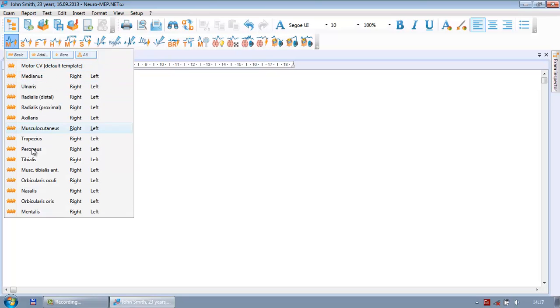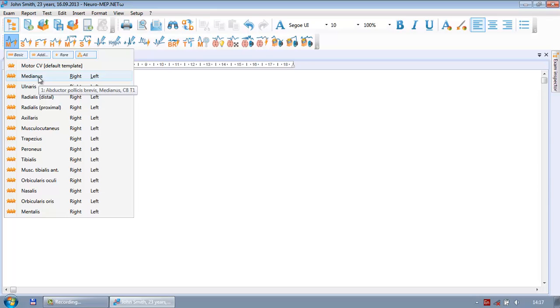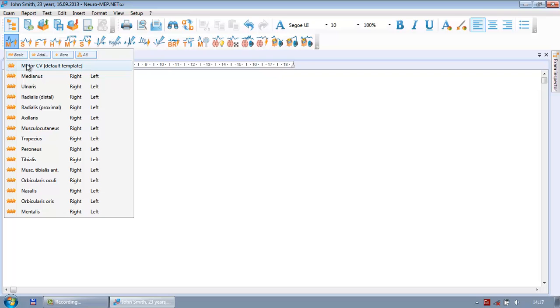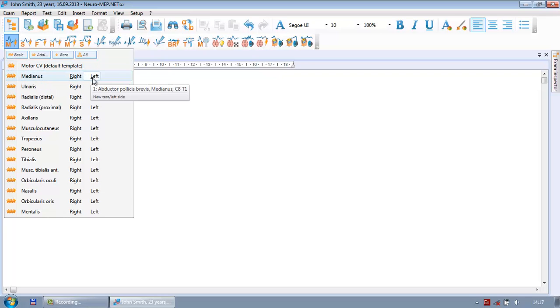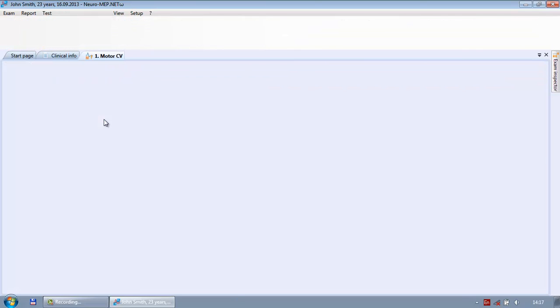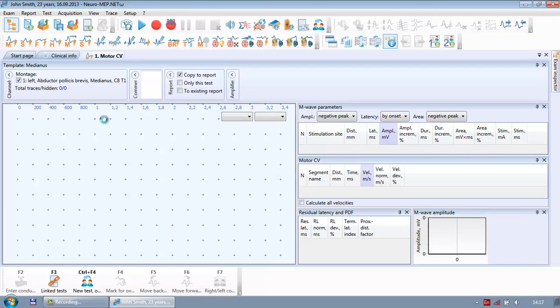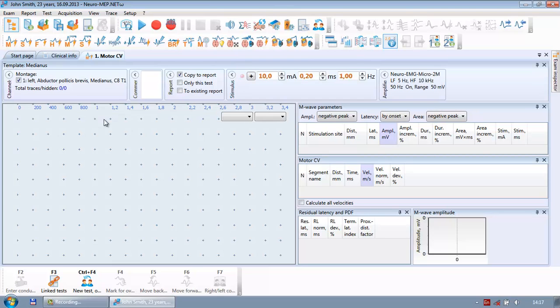You see the list of nerves which can be tested. If you don't see the nerve you need, you can create a new one. We will start with the medianus and we will do the left side, so I move the mouse to medianus and select the side with one click.